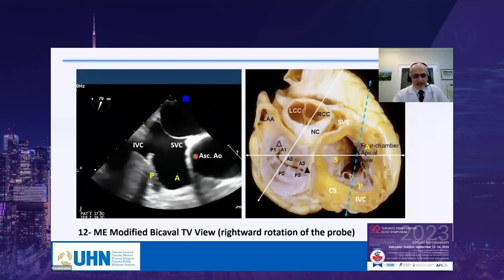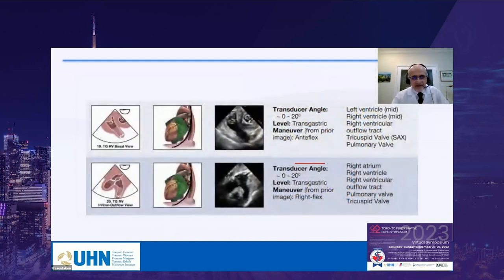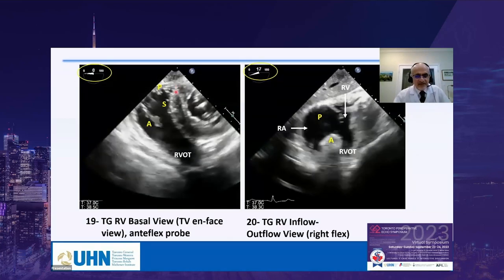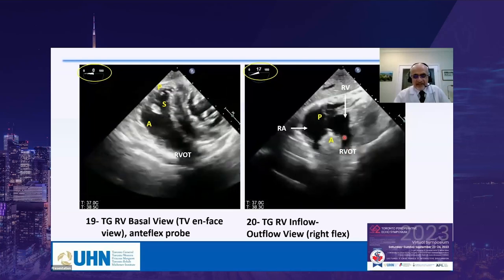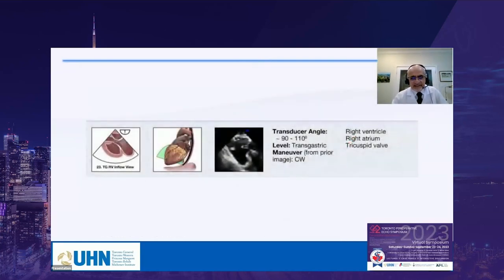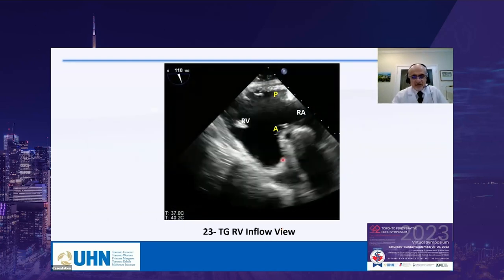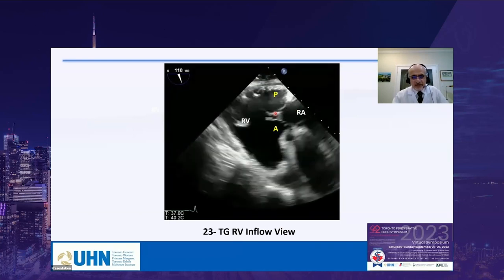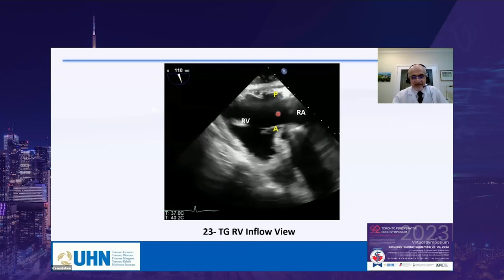In view 12 — the mid-esophageal modified bicaval TV view — we see the anterior leaflet and the posterior leaflet. In view 19, the transgastric RV basal view, we see all three leaflets: septal, posterior, and anterior. In view 20, the transgastric RV inflow-outflow view, we see the anterior and posterior leaflets. In view 23, the transgastric RV inflow view, the anterior leaflet is at the bottom of the image and the posterior leaflet at the top — a very good view for assessing the degree of TR and aligning Doppler to measure the RV systolic pressure.